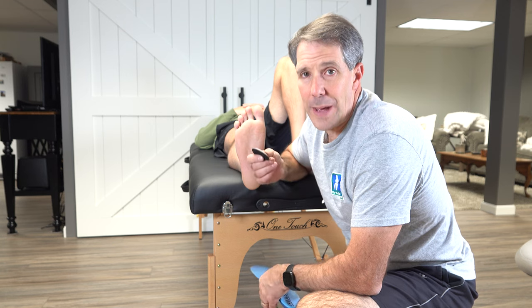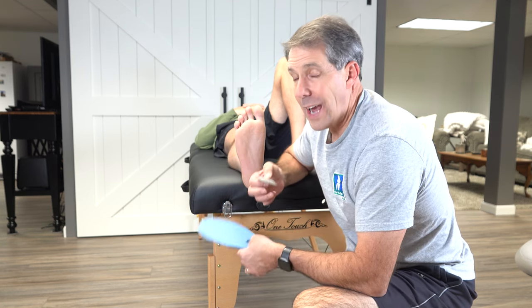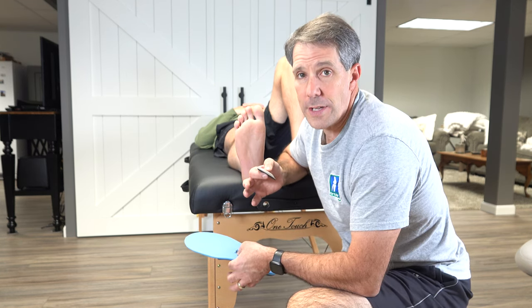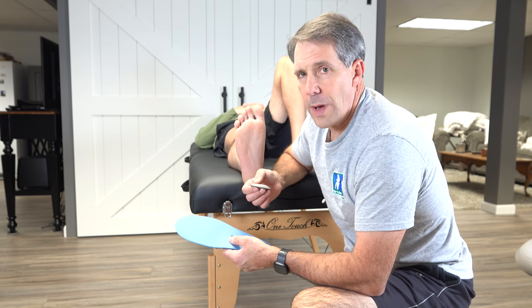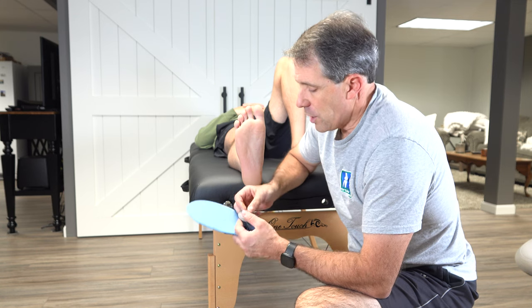Hey everyone, this is Paul from OrthoEvalPal. I had to do a video about how to place a metatarsal pad onto an orthotic — I get this question so often, it's incredible. So I think we should probably start with what is a metatarsal pad?